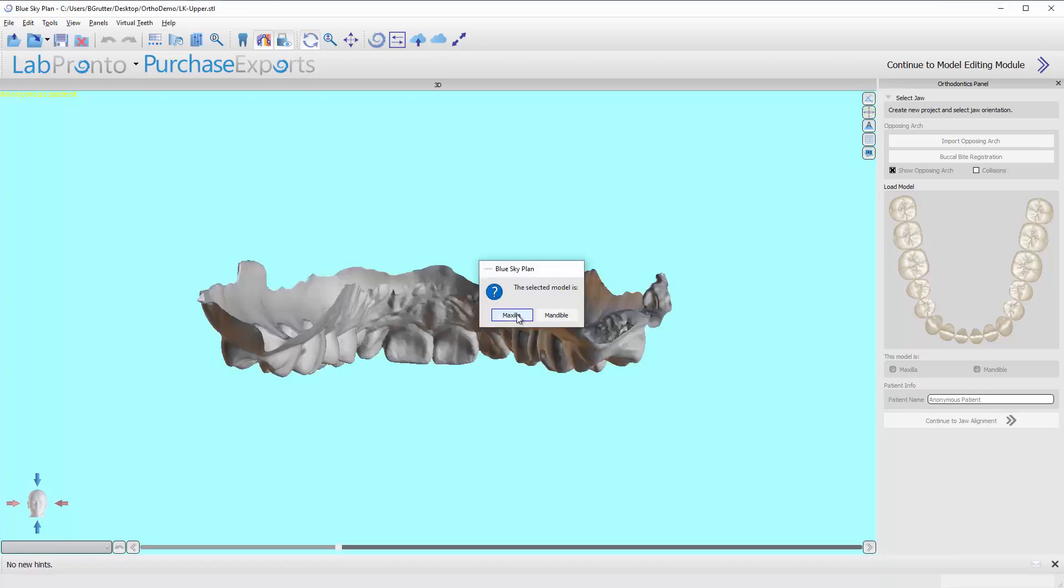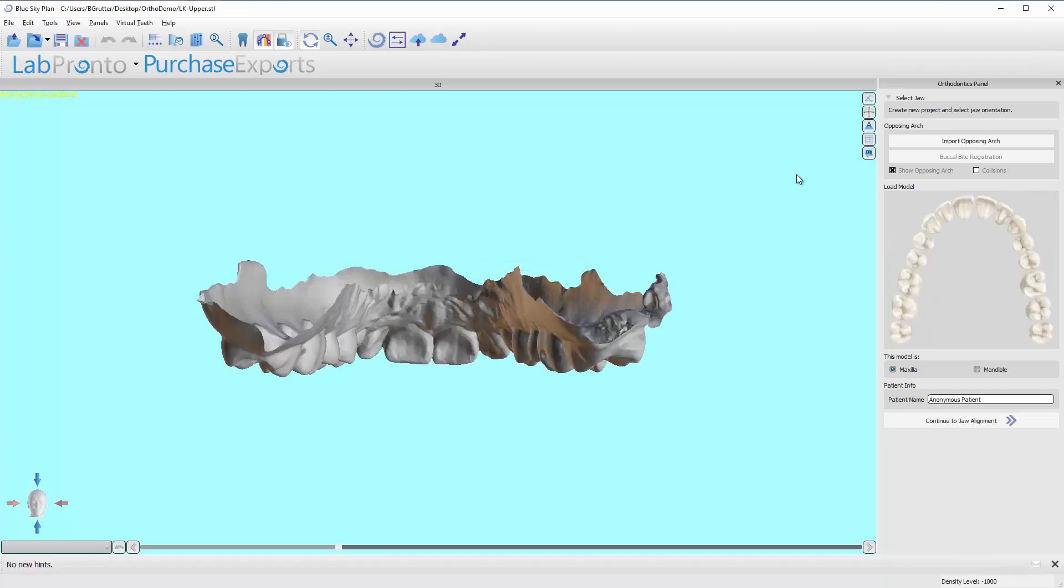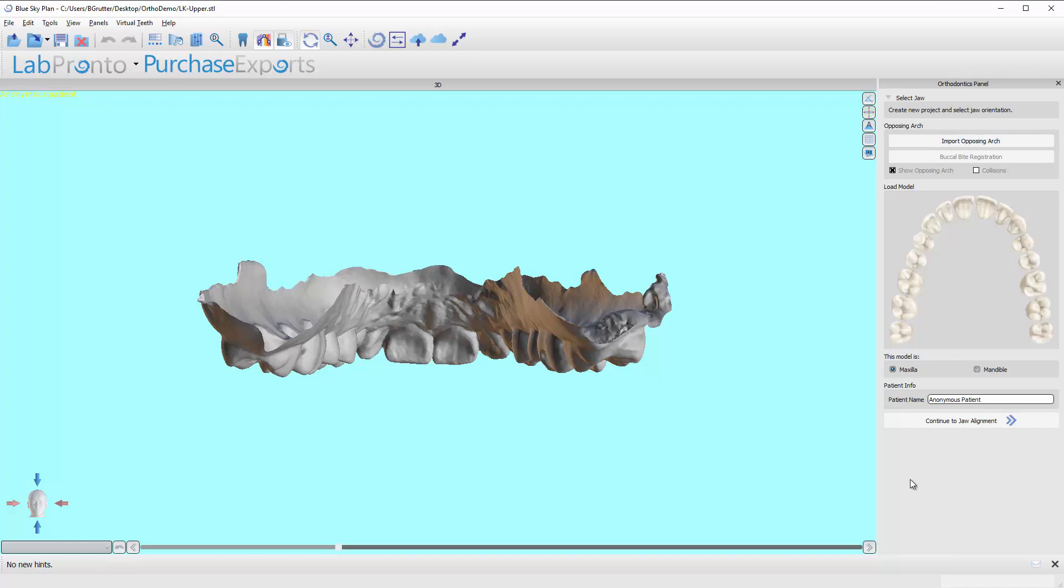Click on maxilla and now for most of the software we're going to be following the top right or the right side which is the orthodontics panel. We're going to work from top to bottom. Before I get into that I do want to cover some of the buttons up here just in a general sense so you know what they are and what they do in the software.